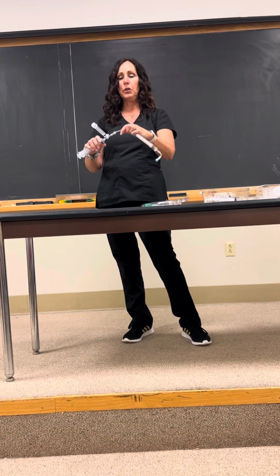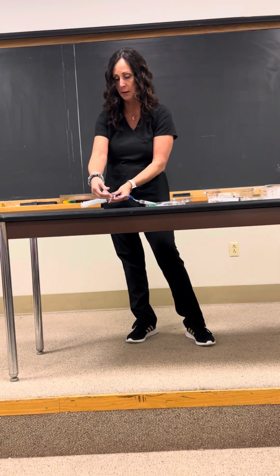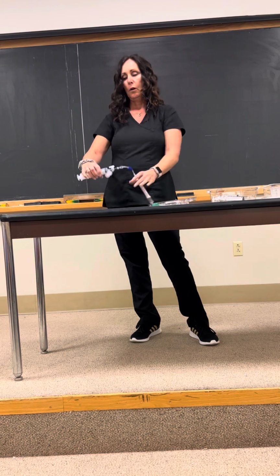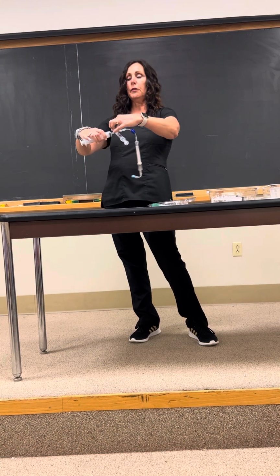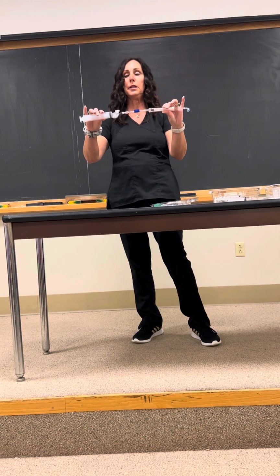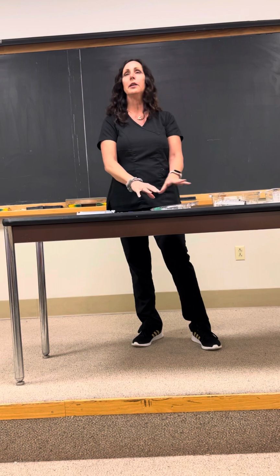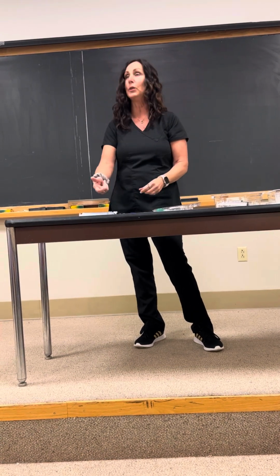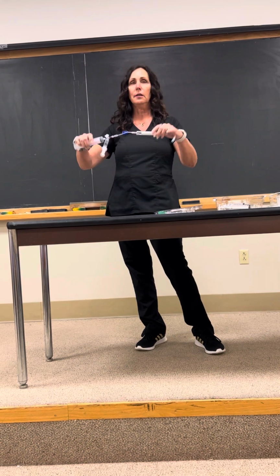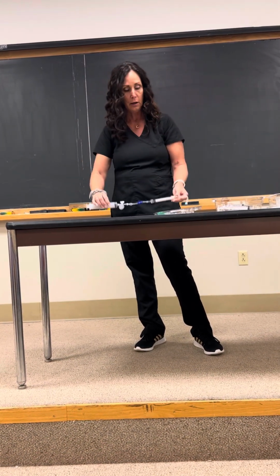Then you can unlock your clamp and pull your heparin into this syringe. Once you do that, you switch your clamp to that syringe so that you're ready to filter into the 60. This is nice because it saves your heparin. If you end up with a really bad clot in that filter, you can disconnect your heparin and run it through the filter again. So it's just a safety net to have your heparin sitting in that syringe for you if you need it.